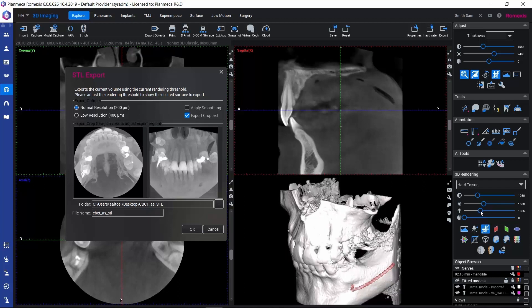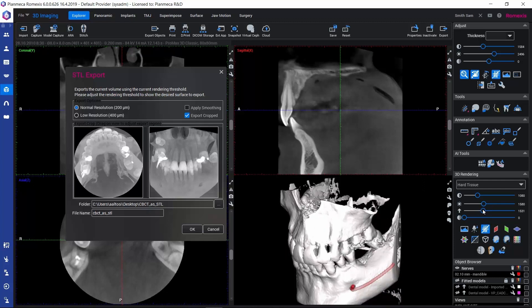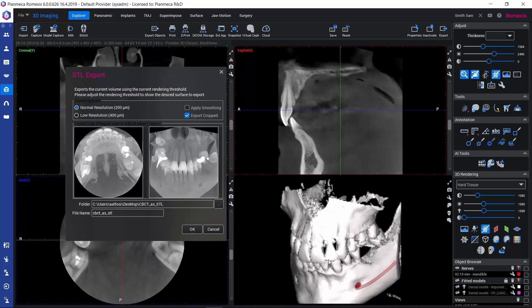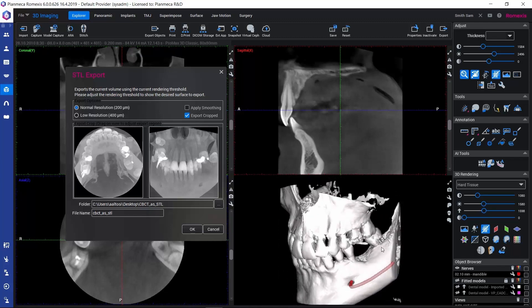If we move the slider a little bit, we can get rid of some of the surface and we can get a cleaner surface model to be exported.